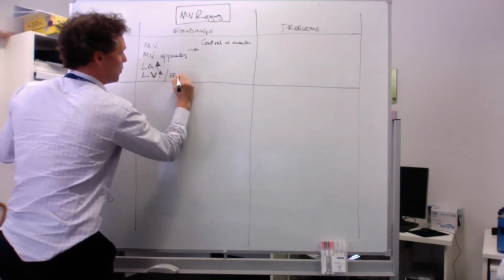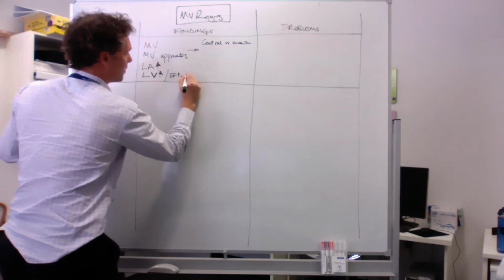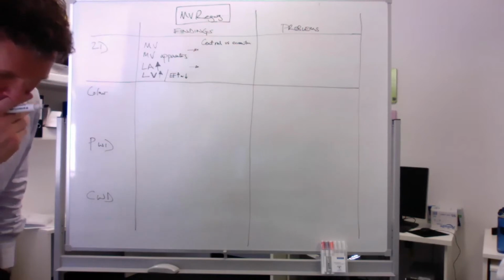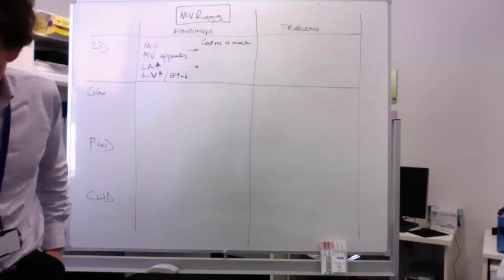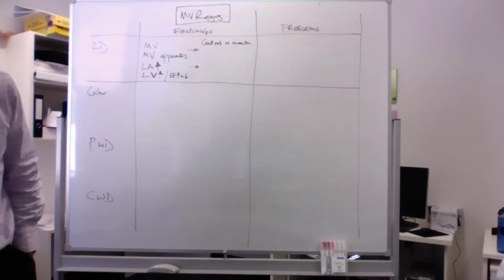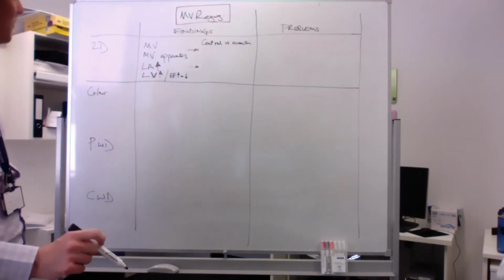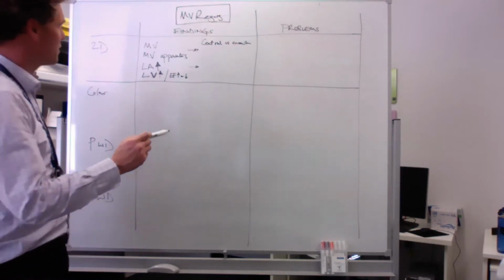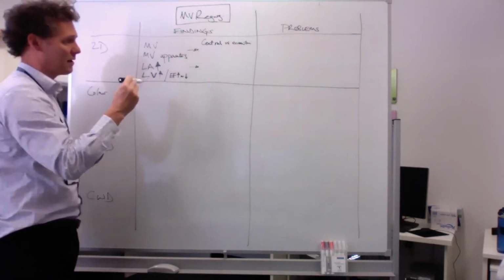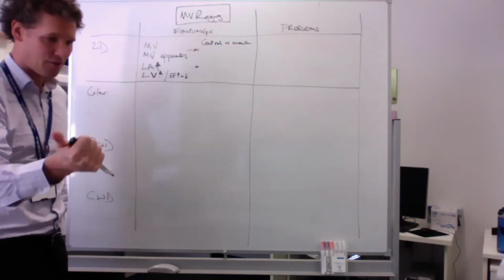So who said increase? When the LV is not dysfunctional, it's going to increase because there are two outlets for the left ventricle. But as LV dysfunction creeps in, ultimately it will come down in a chronic state. Yeah, nice. So I think these things are going to help tell you about severity and chronicity, as you were saying.